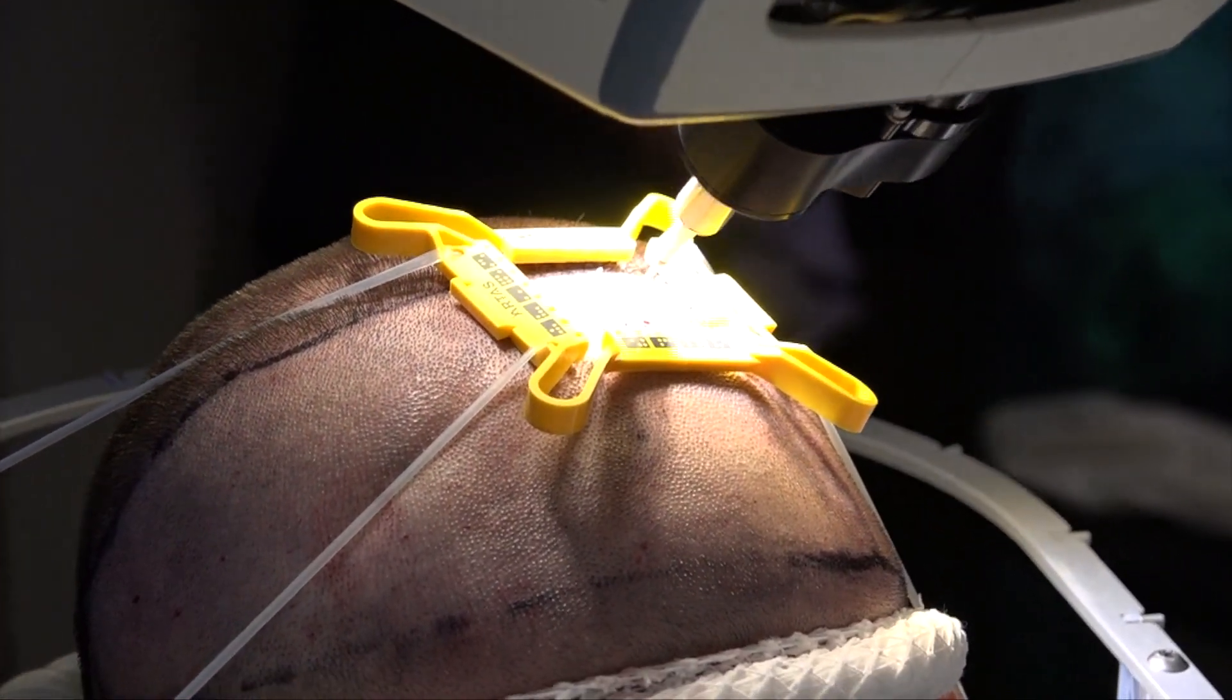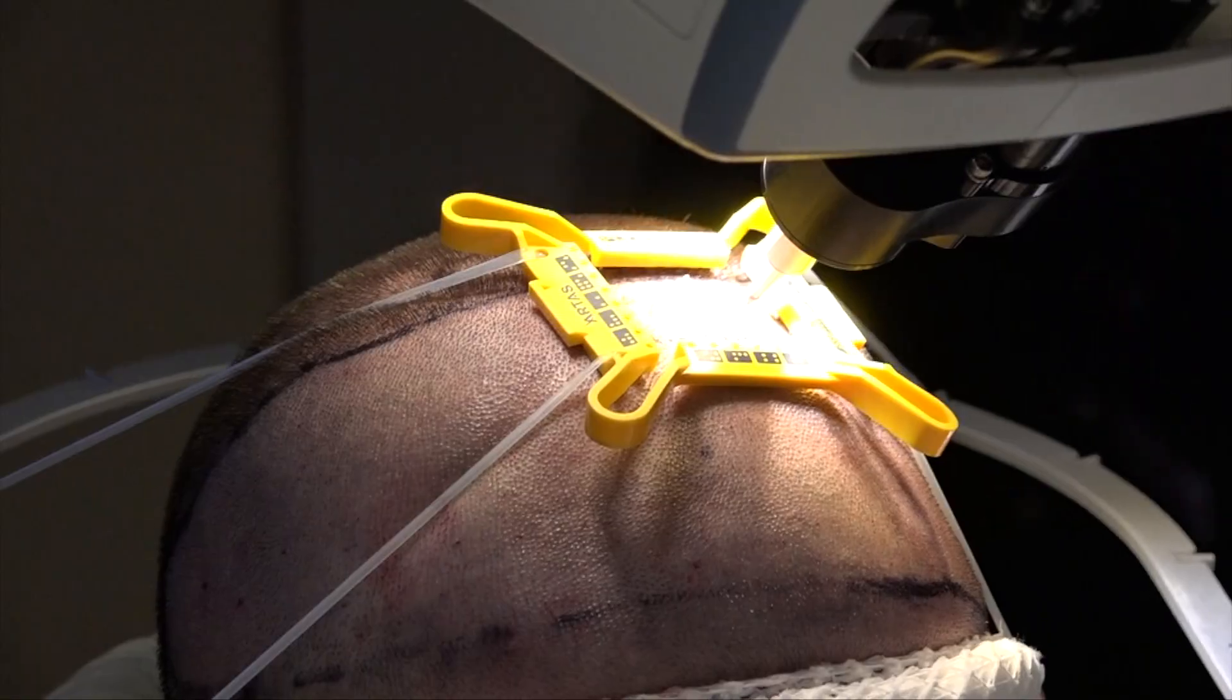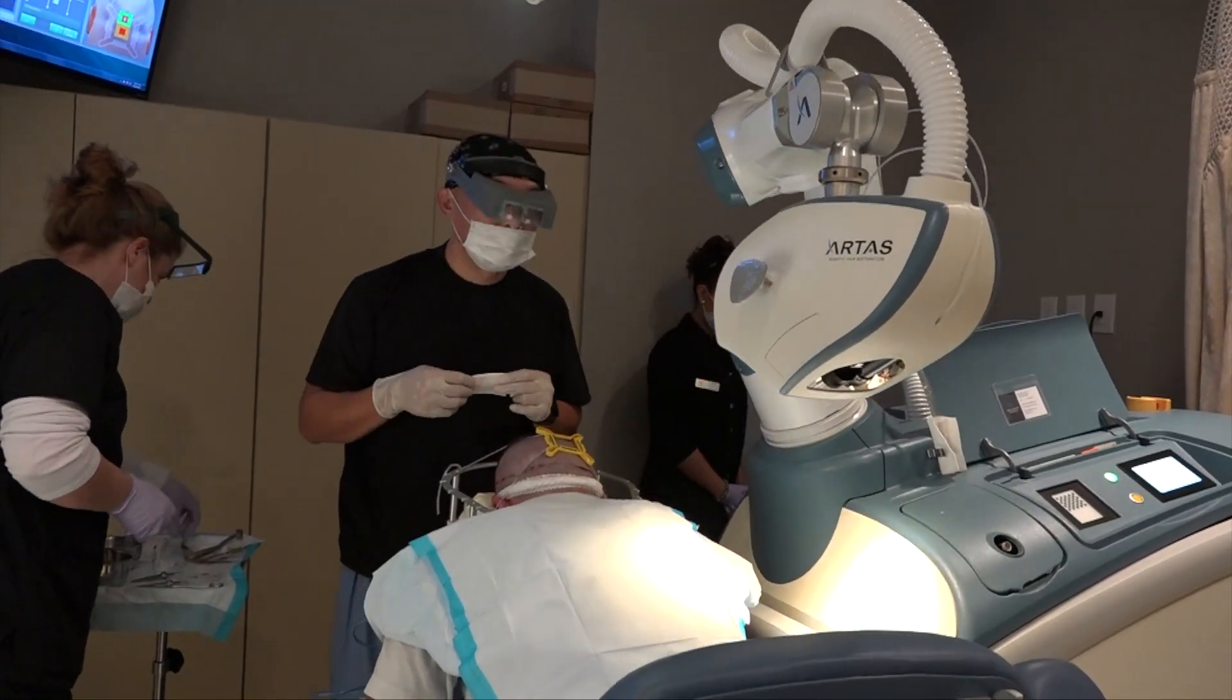There's no pain. You can feel nothing as the robot is working across the back of the scalp, guided by the physician to extract the follicles.